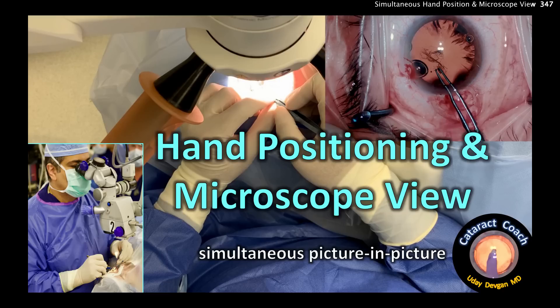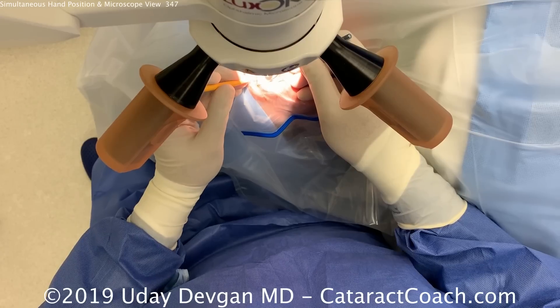Cataractcoach.com. This video demonstrates hand positioning and the microscope view simultaneously in cataract surgery using the picture-in-picture feature.